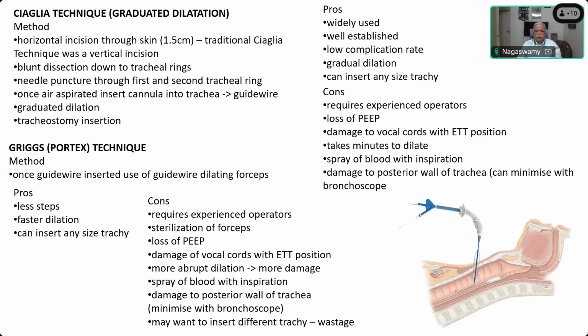So this is shown here. This is not related to this picture, but this description. This is called the balloon dilatation tracheostomy. So I will describe it later.